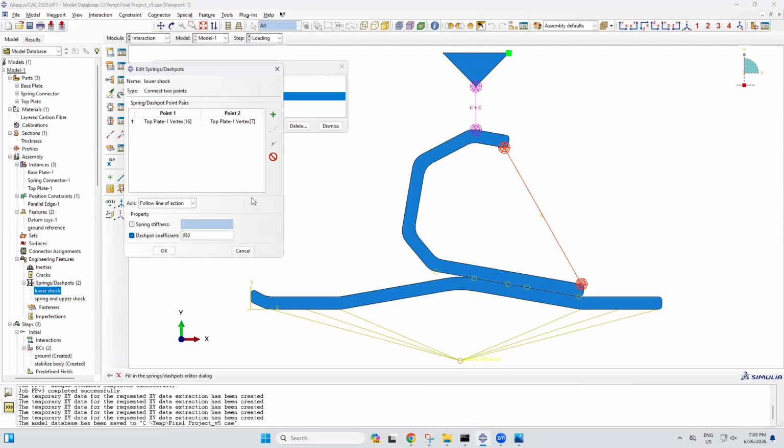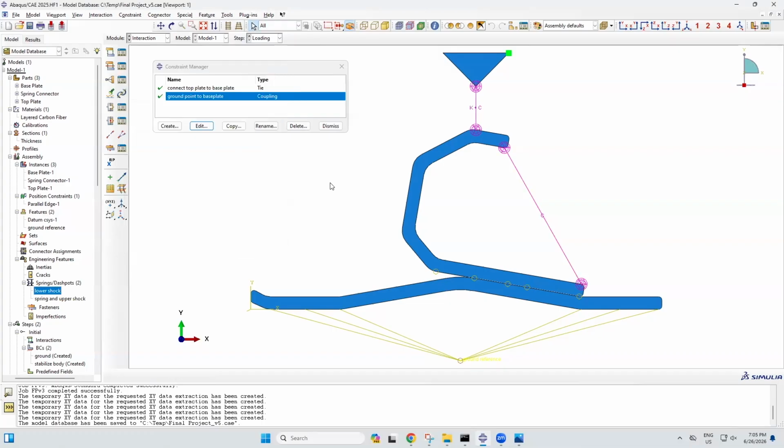This dampener helps the plate reach an equilibrium, much like the upper shock when the person is standing on the prosthetic. I did have to mess around with the dampener values for a while, and you can have an overdamped system, where the dampener is too firm and there will be no oscillations, which means that the part will not exceed its deformations, but will instead just go to exactly what its deformation would be. Additionally, you can have underdamp where there will be multiple oscillations, and I found that the spring connector part would pass through the top plate, which is very unrealistic.